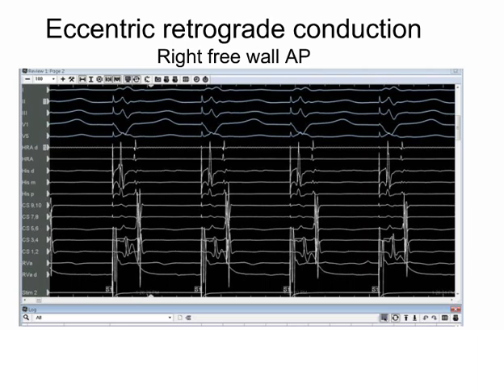So then we begin to pace the ventricle, and we're looking at what's happening retrograde. In this case, we would normally expect the His bundle catheter to be the earliest, followed by proximal to distal coronary sinus, and the high right atrial catheter to be late, somewhere out in the mid-coronary sinus or sometimes even later, depending on where you put it. To see the right atrium line up with the His is funny, so we recognize immediately this conduction looks a little funny. The other thing you notice is the P wave in lead 2. Upright. Conduction through the AV node does not produce that.